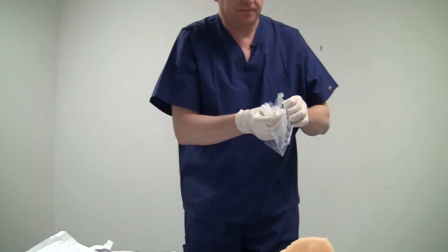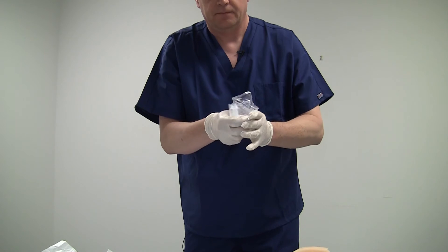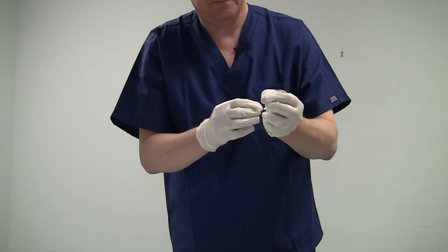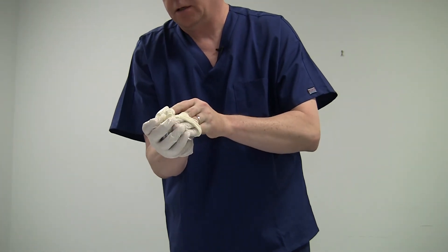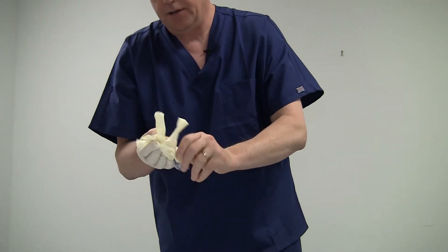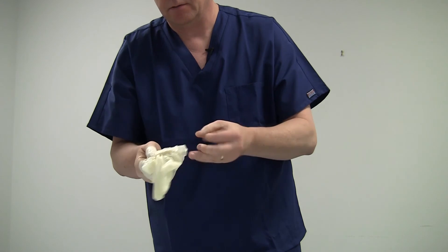Finally, when you're all finished, take everything in one hand. Take your first glove off, your second glove off, and you never come in contact with the patient's fluids either.